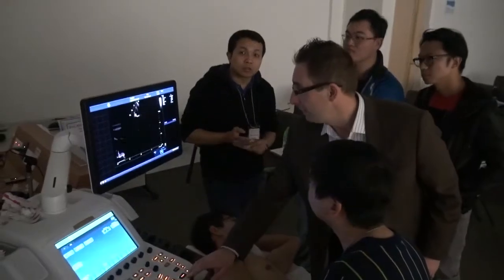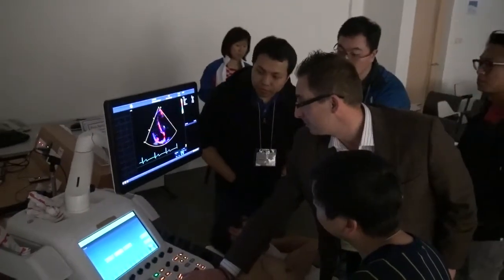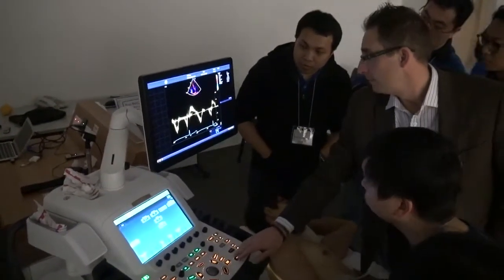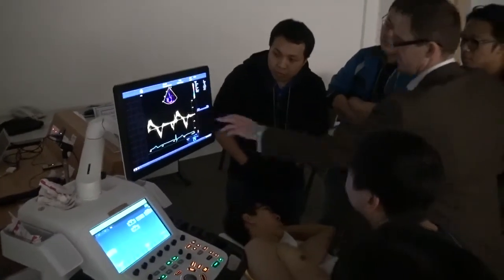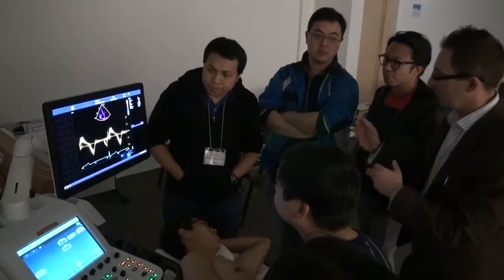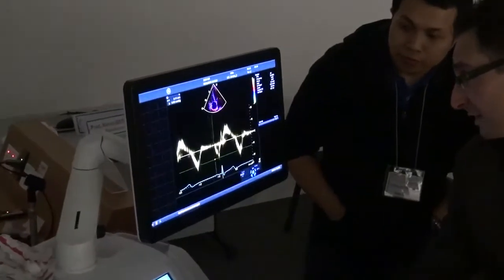Okay, so if we unfreeze up there, I'm going to do a tissue Doppler as well. Same principle applies. But now instead of looking at displacement, we're looking at velocity. And what's great about this technique is not only do you get systole, which is a systolic velocity as that wall moves up, but also diastole as well. So you get the E and the A, the early passive filling and then the atrial kick. So if we caliper here, we measure the velocities of 14, 16, and 11.